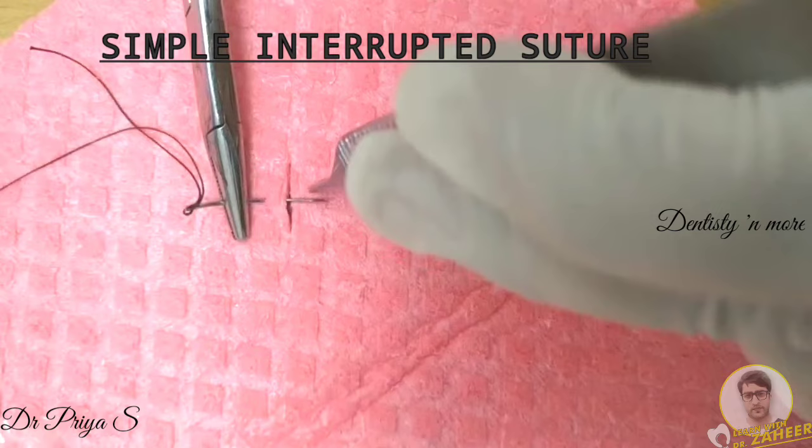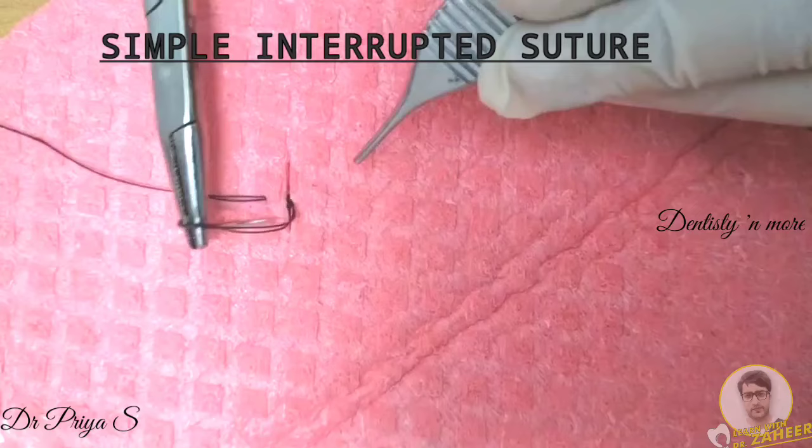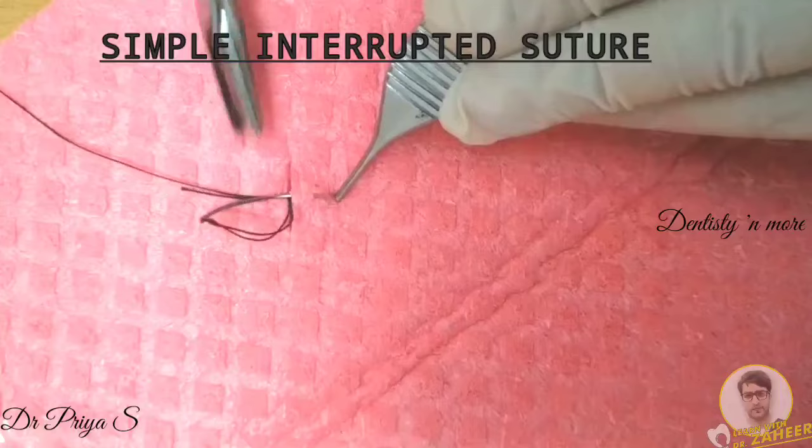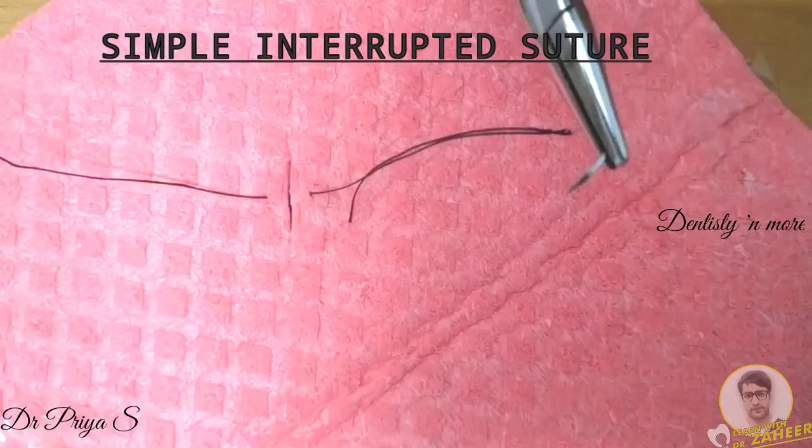Make the needle rise out from the middle of the wound. It is then pierced on the opposite side of the wound at the same distance and depth as the first pierce. Then pull the suture material through the wound, leaving only 3 to 4 cm at the tail end for the knot tie.